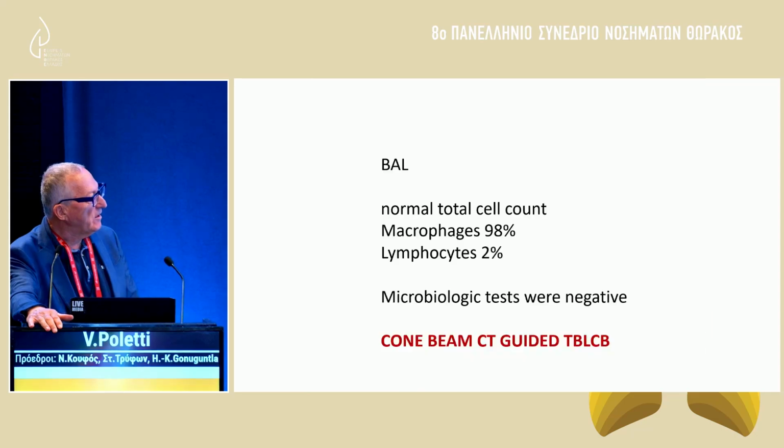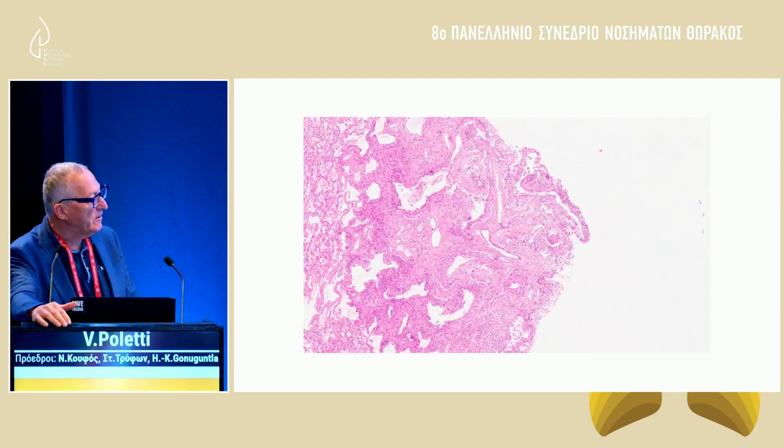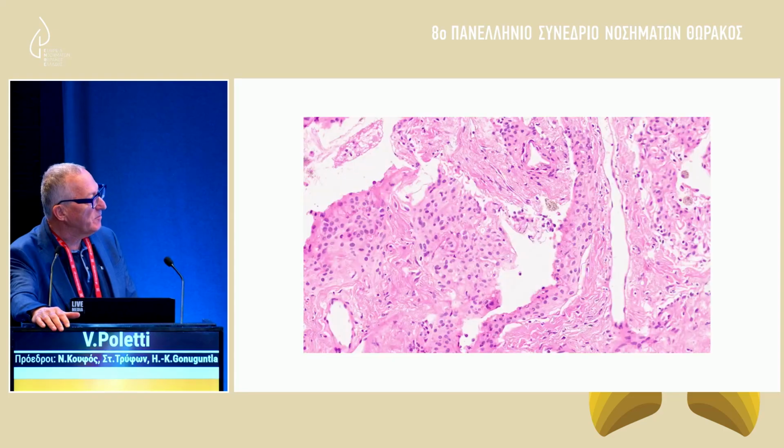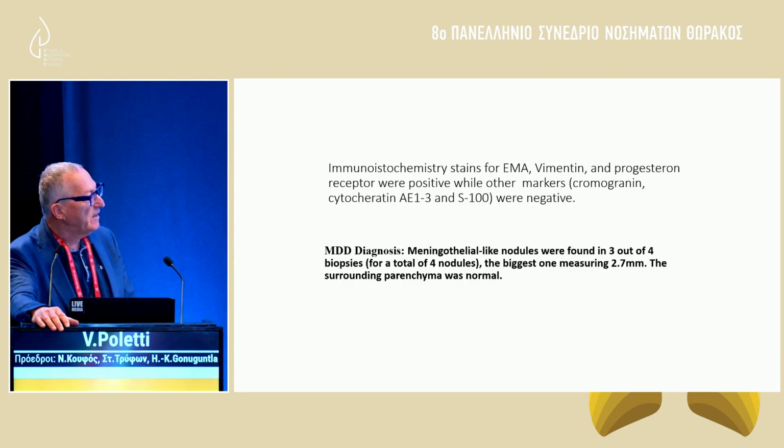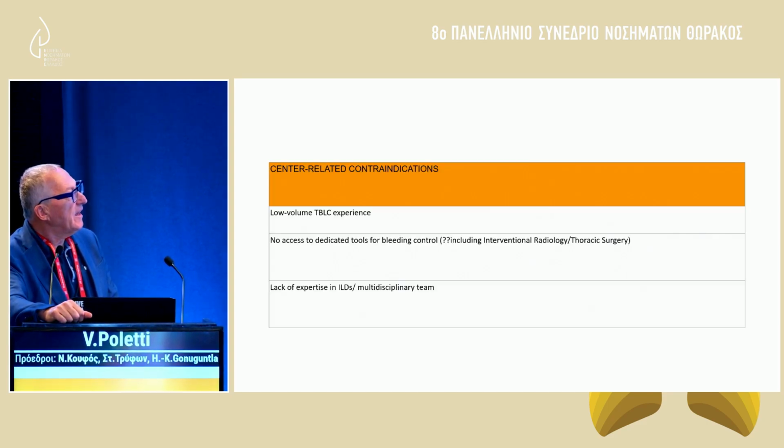Here the perfusion is very mild, and this was the diagnosis. Nodules, yes, but consisting of meningothelial-like cells, and the final diagnosis was meningothelial-like nodules. That is a very rare entity.